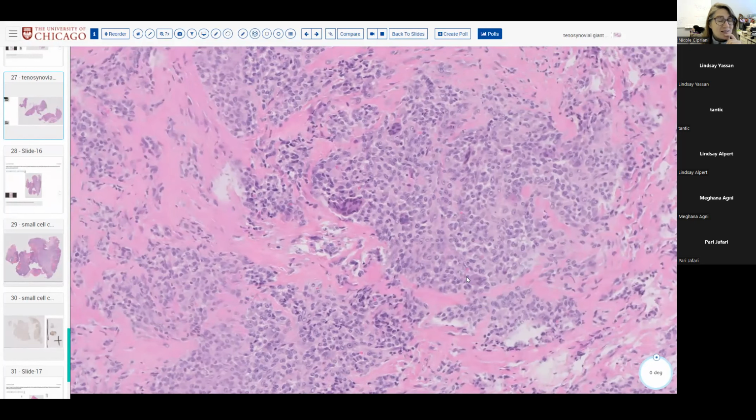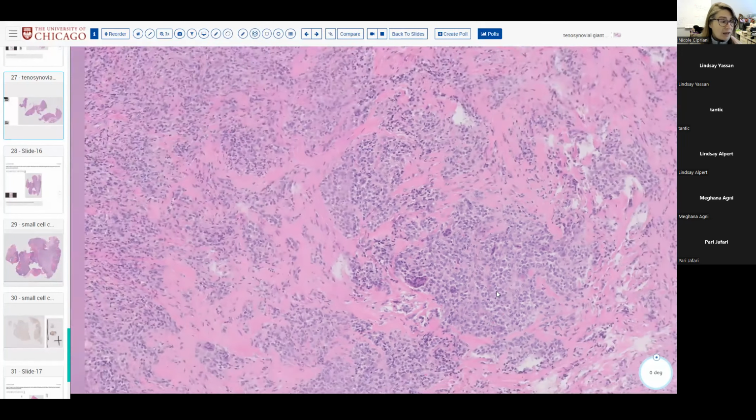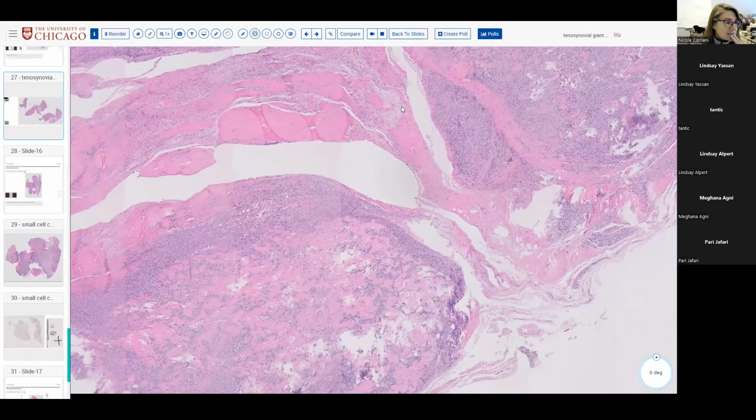As with most giant cell rich lesions of bone and soft tissue sites, the giant cells are bystanders, and the lesional cells are these background mononuclear cells that have a histiocytoid appearance with grooved, wrinkled nuclei. And if you're lucky, you may see foamy, xanthomatous histiocytes.